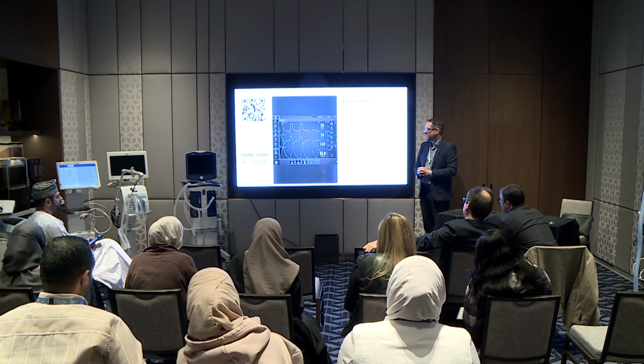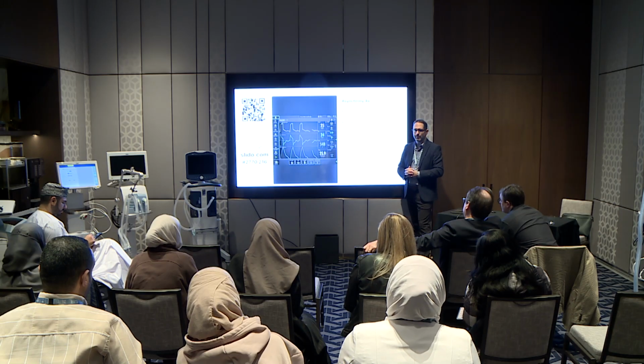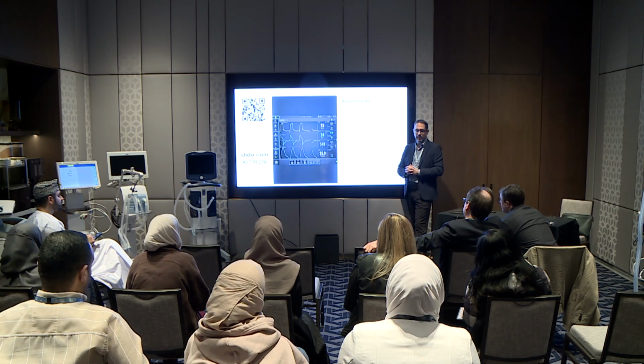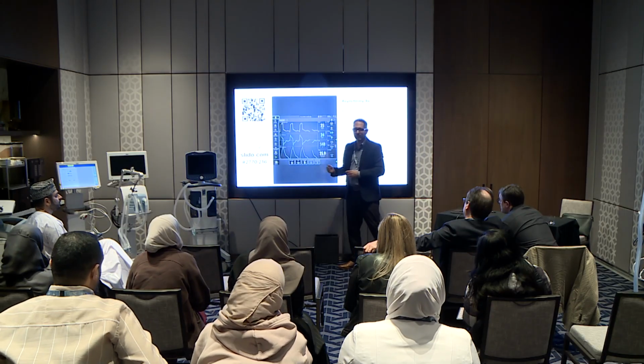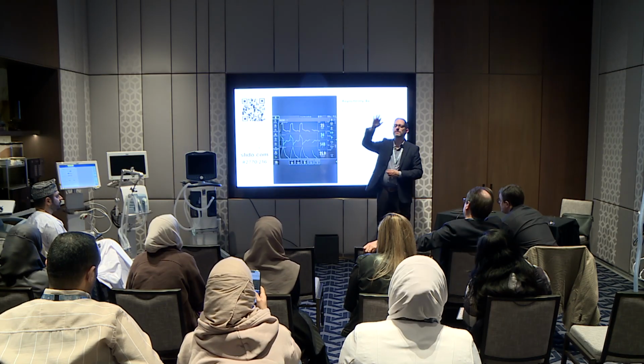But the level of assistance sometimes is difficult to determine, but knowing that in pressure targeted modes, if the patient is pulling in a lot of volume on their own, what should the inspiratory flow look like? It will be more rounded. If they're pulling it in, it's more rounded.